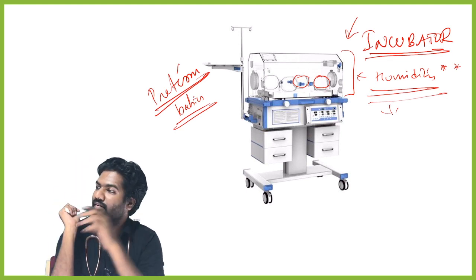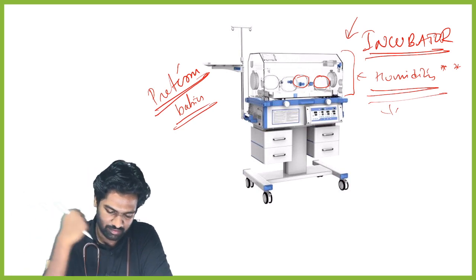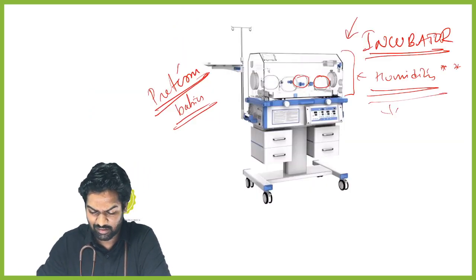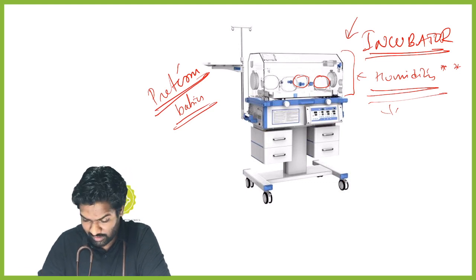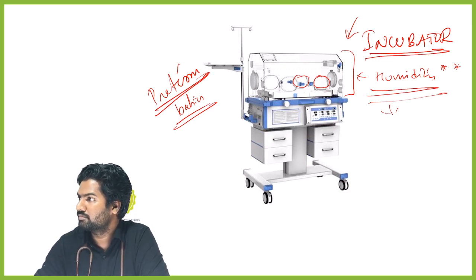Now the question is whether a radiant warmer is better or an incubator is better. As far as I have seen, incubators were used exclusively for preterms. What they saw in the long run, in recent studies, was that this humidity was causing sepsis in the children. So that is why they ended up using the radiant warmer only.